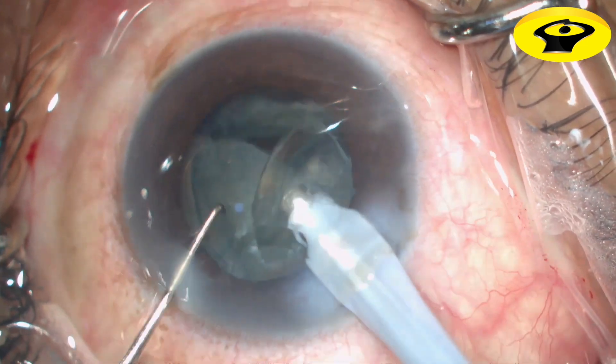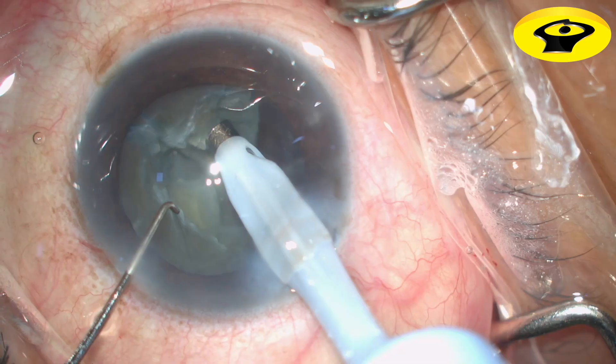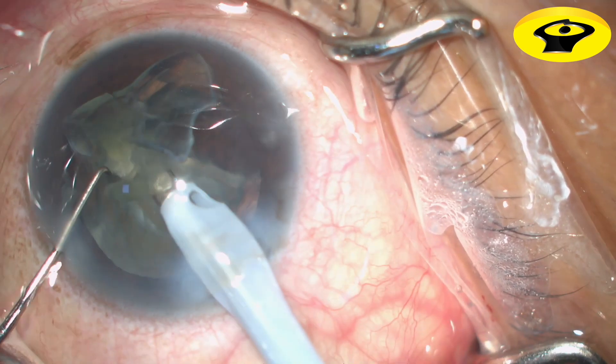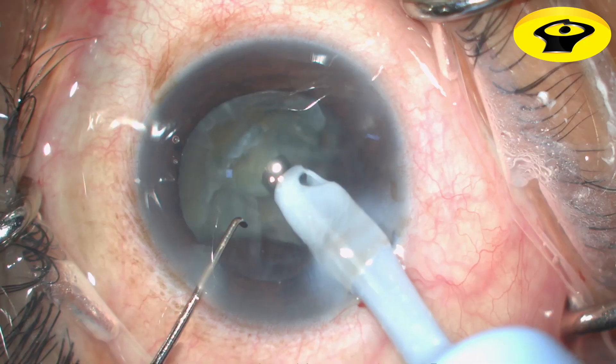Make sure that you have sufficient space from the corneal endothelium to the phaco probe. If the nuclear fragment is large and too big to be emulsified, it can also be broken down into smaller fragments and then emulsified.